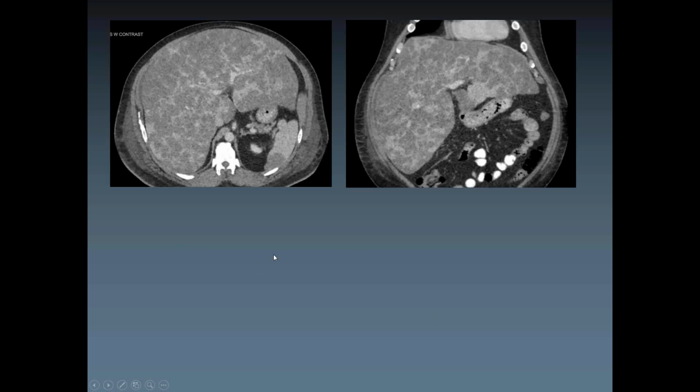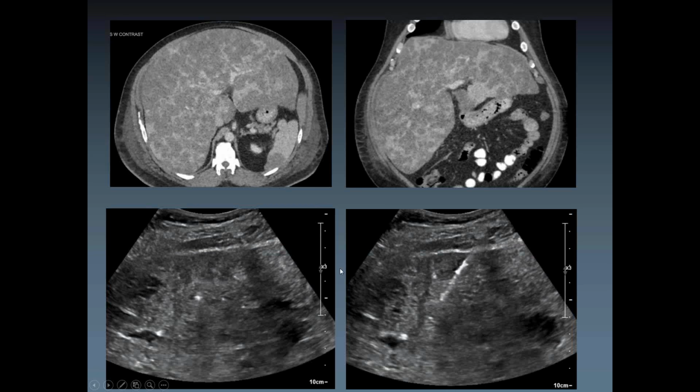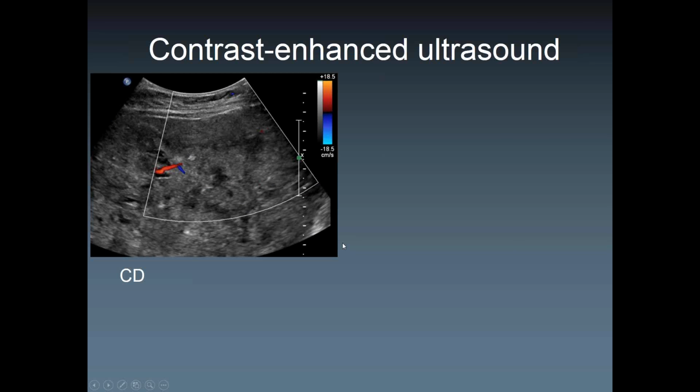All right, how about this poor patient? This patient was 36 years old, had some pain, and has this kind of mass in the spleen and also many masses in the liver. You could think that it's not difficult to biopsy that. We biopsied and it ended up being all necrotic tissue, so we didn't know exactly what was tissue, what was liver, and what was necrotic target. So in order to identify where target tissue would be, the patient had to come back again.